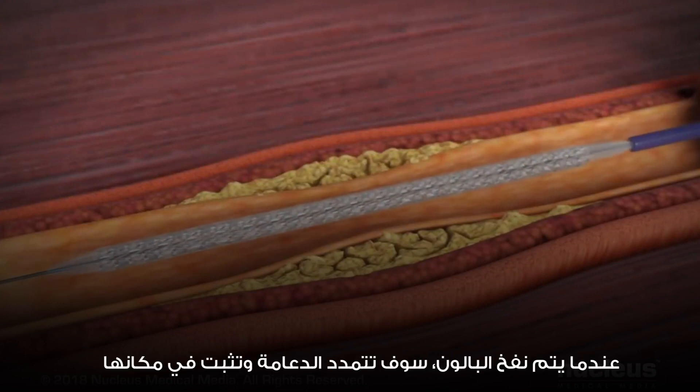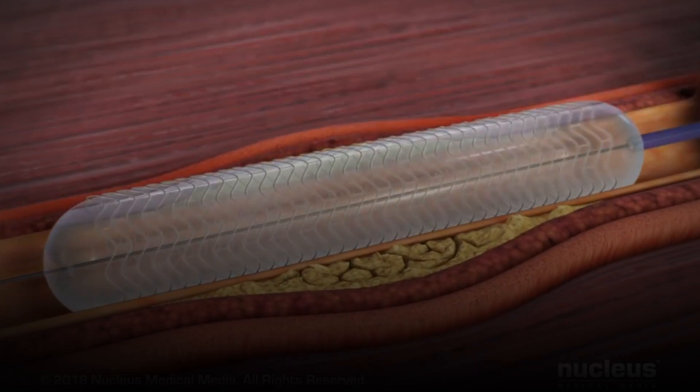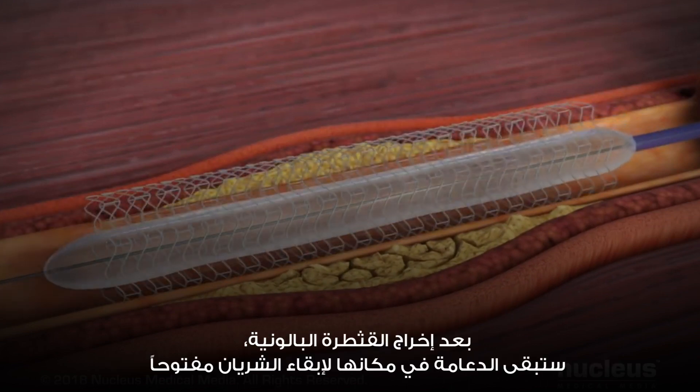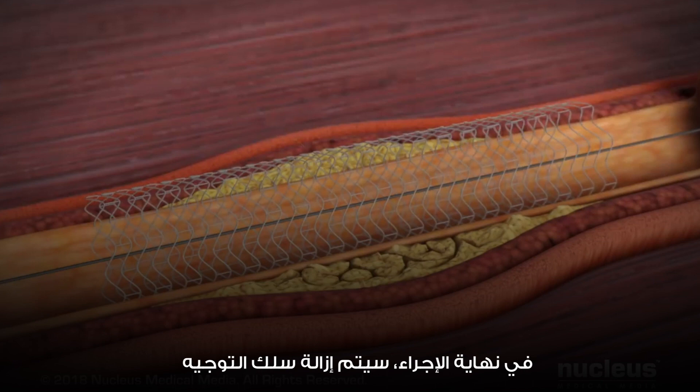When the balloon is inflated, the stent will expand and lock into place. After the balloon catheter is taken out, the stent will stay in place to hold the artery open. At the end of the procedure, the guide wire will be removed.